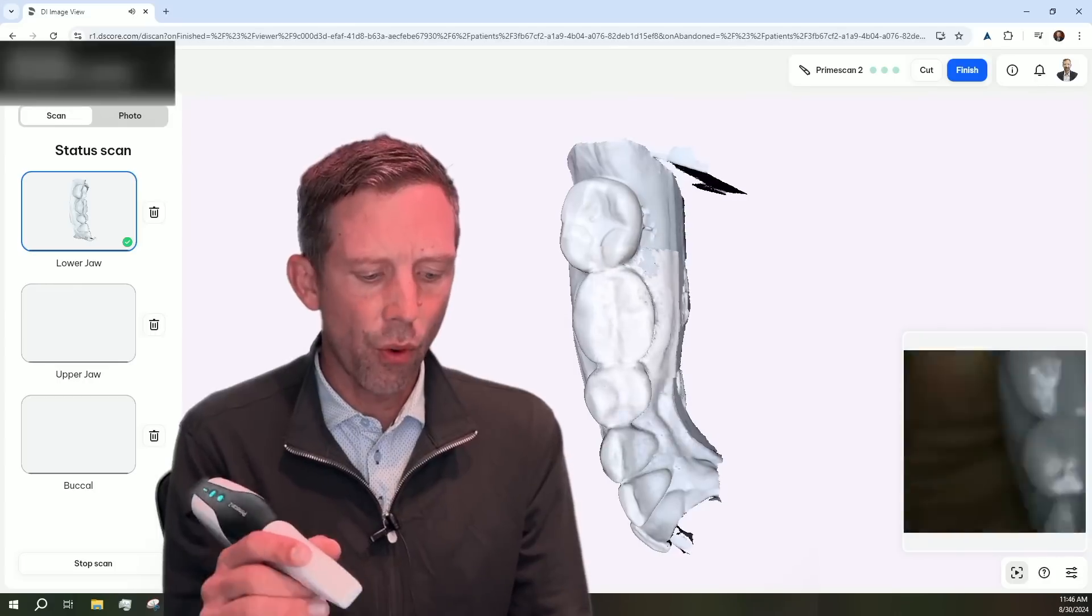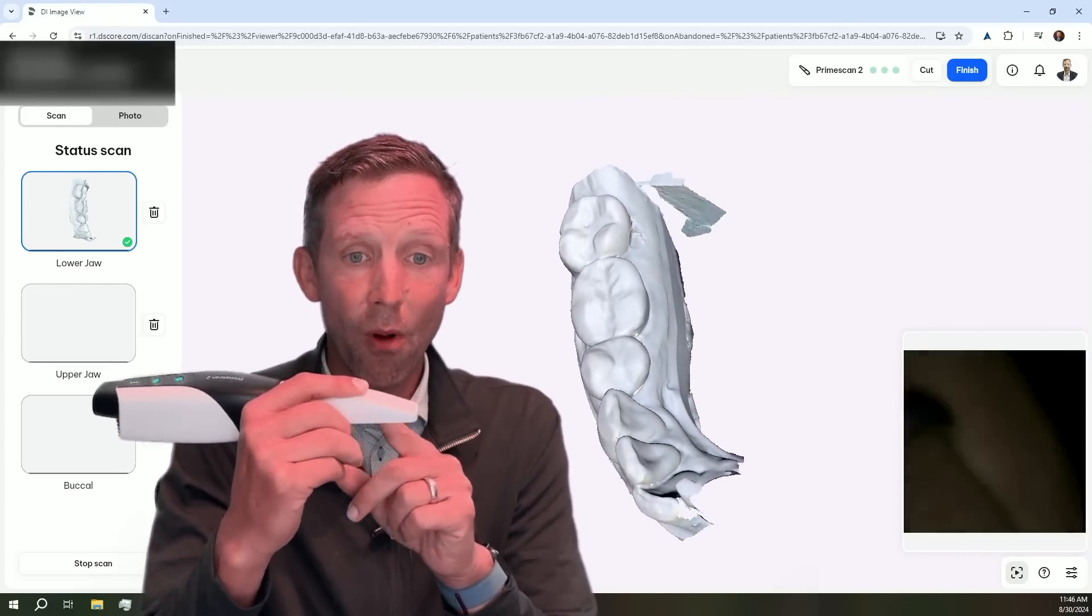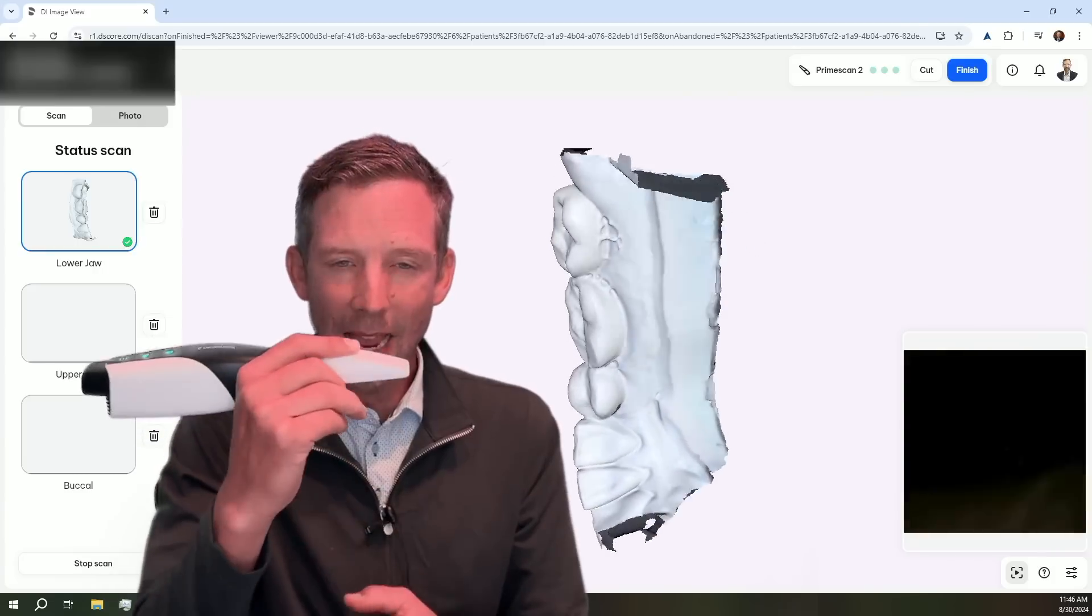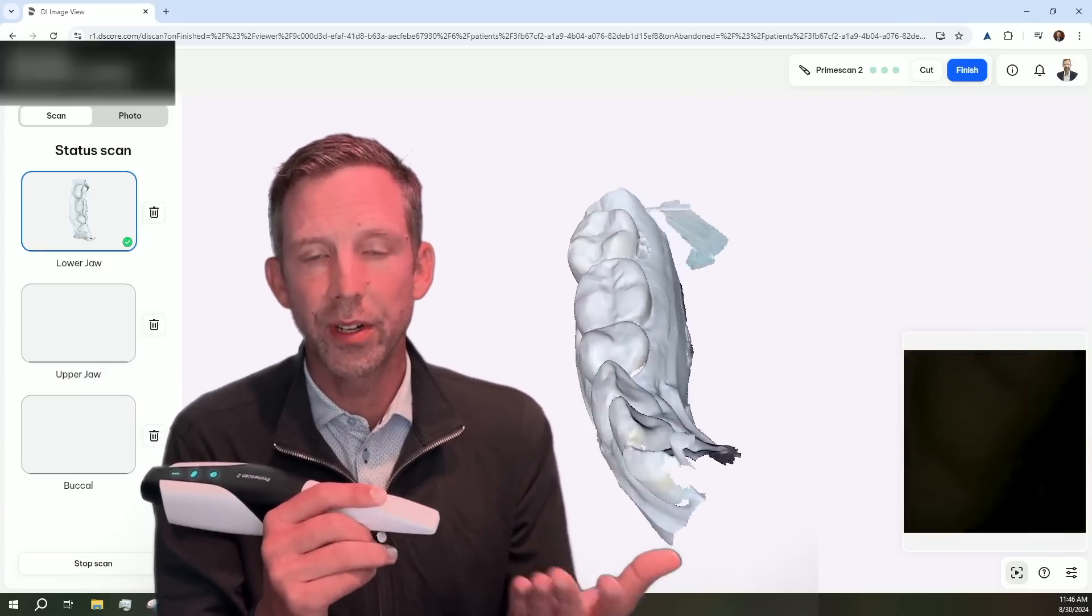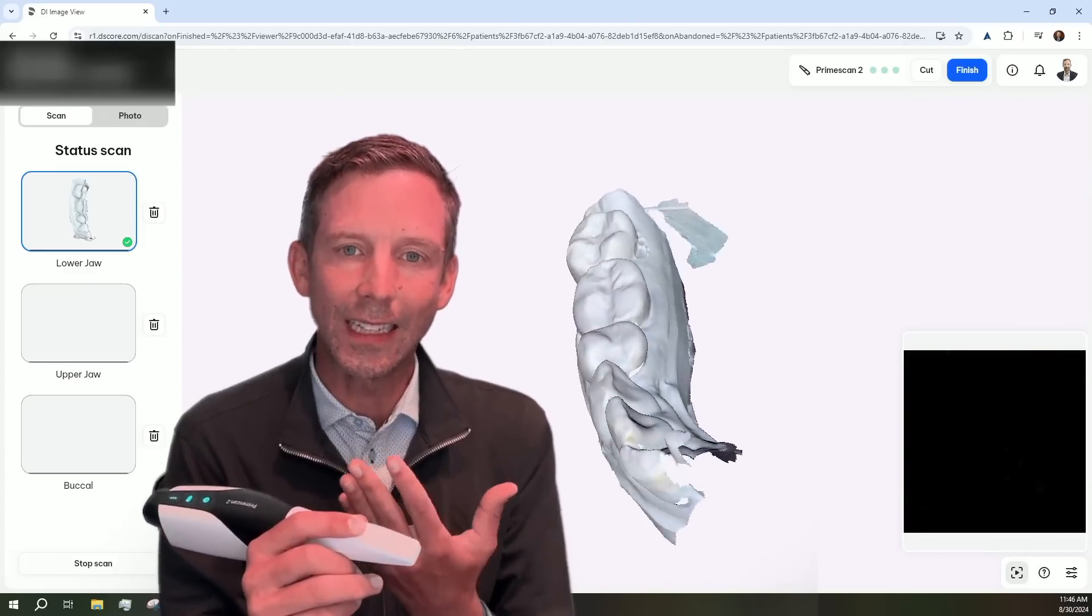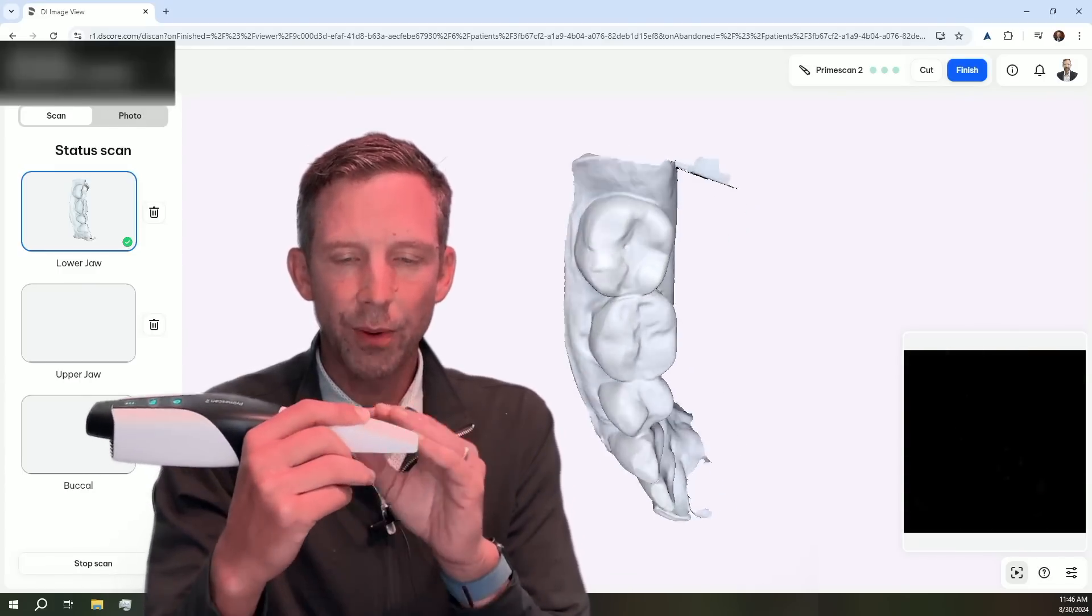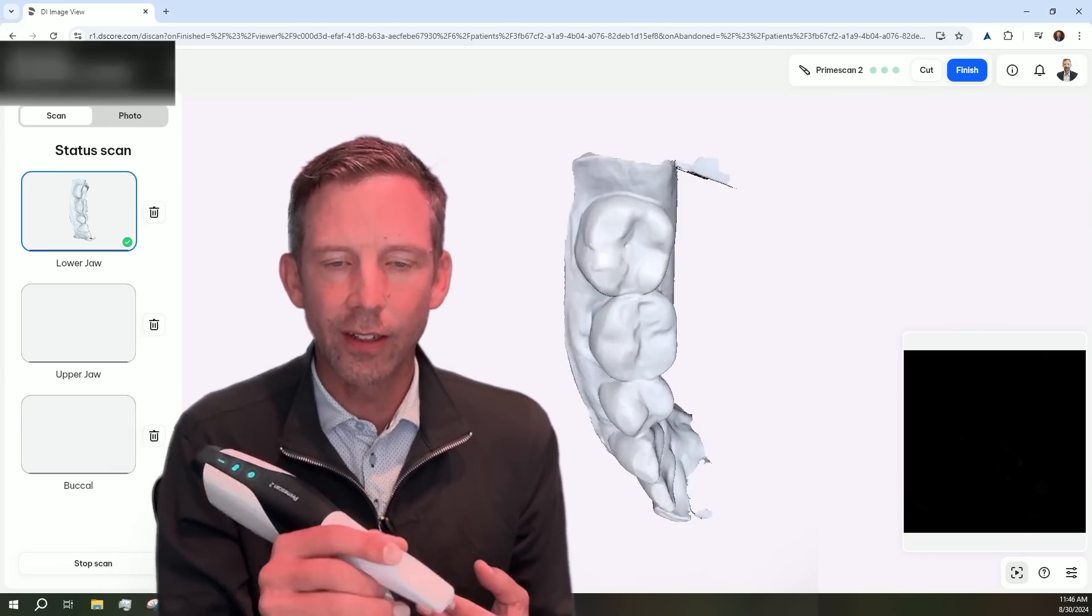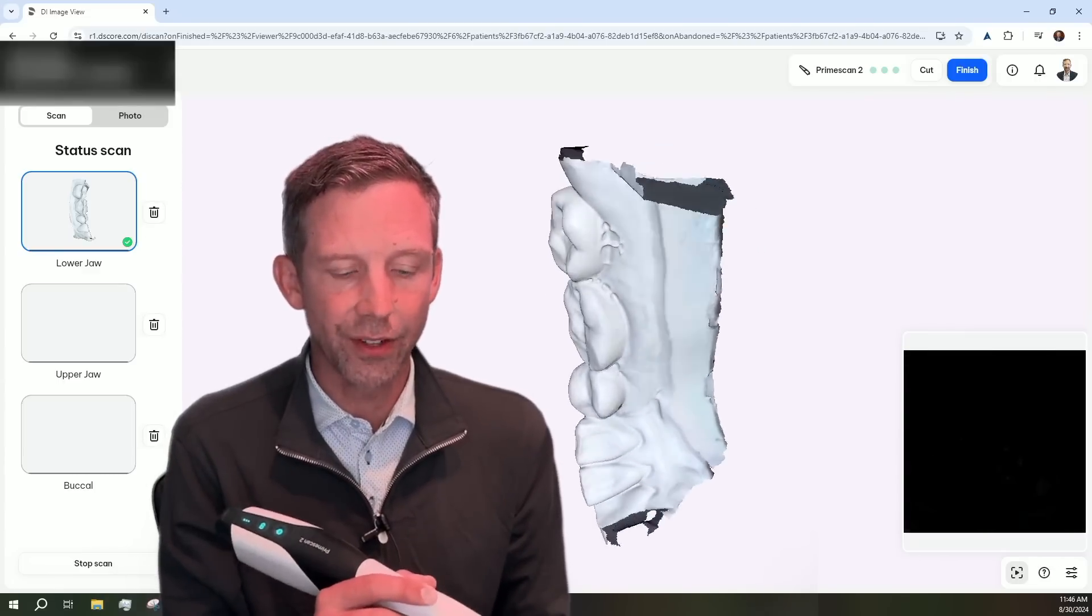And just a little point about the new scanner here is that this tip is much smaller than the PrimeScan 1. So meaning I'm able to fit this in much tighter areas. I know that's been one of the complaints with the original PrimeScan. Awesome scanner, just gets a little bit big into tight spaces there. So with this smaller tip, it's much easier. It's lighter. And my staff has really enjoyed being able to scan a little bit easier.